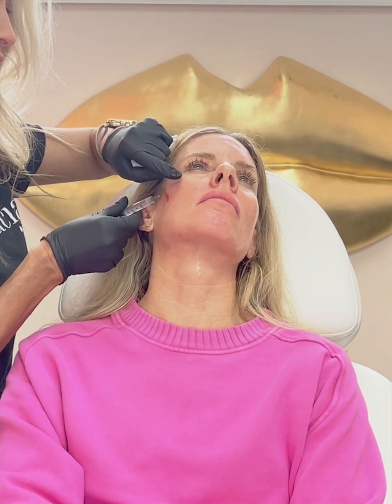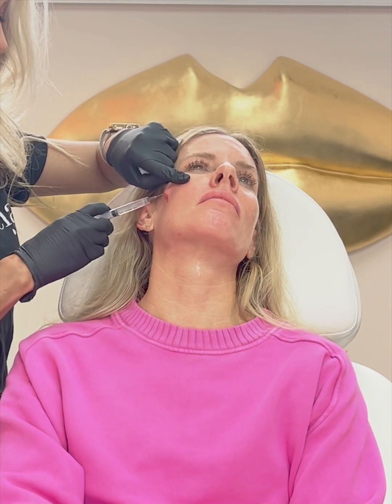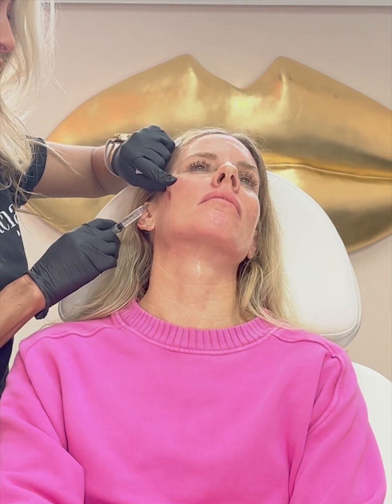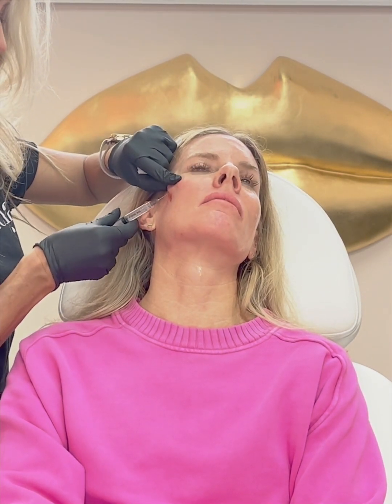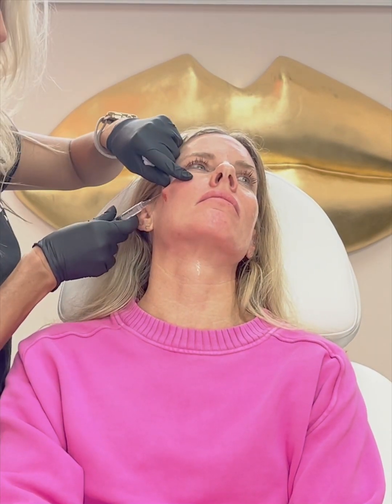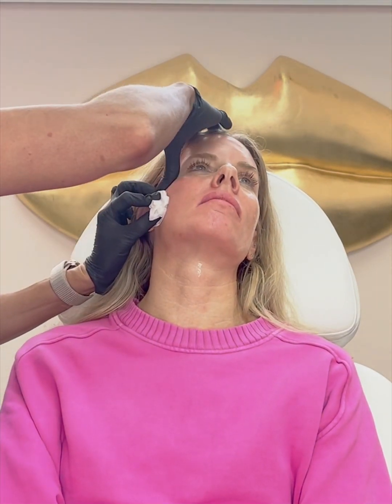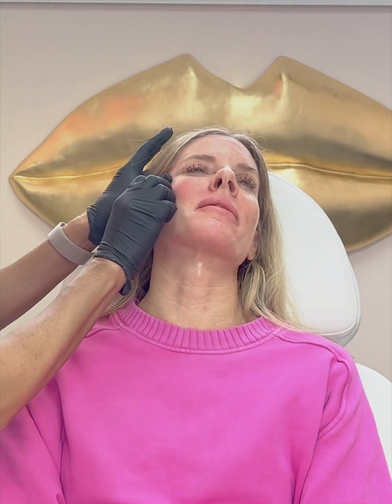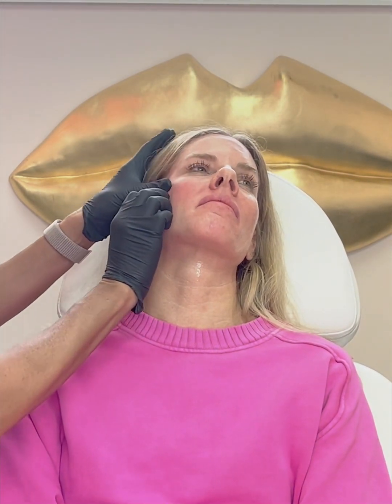Typically, it does take subsequent treatments to get the best results. Rule of thumb is 1 vial per 10 years of collagen and elastin stimulation needed. So I have recommended that she be treated 3 sessions of Sculptra, and then we'll maintenance annually. It has been shown in studies that Sculptra can continue up to the 24-month mark, if not further than that, for producing and stimulating collagen and elastin. They ended the studies at 24 months, and the samples did show that collagen and elastin were still being stimulated and produced. So the results from your Sculptra can go long past 24 months, which is a huge plus.